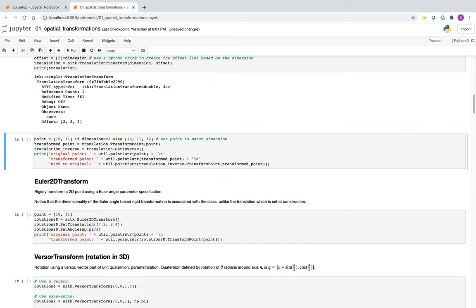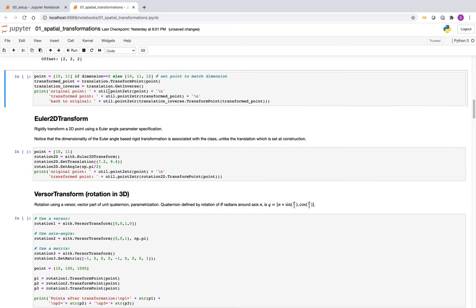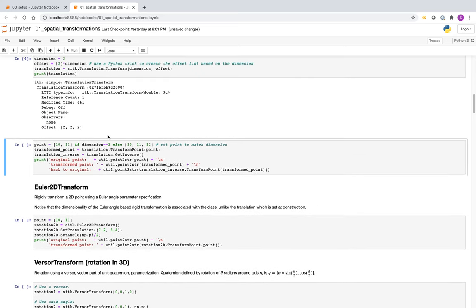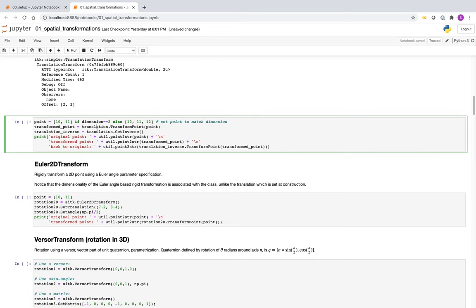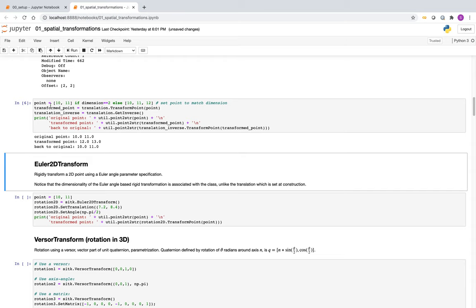Setting the dimension to 3 gives a translation transform with values (2, 2, 2). Returning to dimension 2 and running the transformation: we create a point (10, 11) and apply the translation, getting a transformed point that is just plus 2 in each coordinate, as expected. All global transformations have a get_inverse method, which returns the inverse transformation. Applying the inverse to the transformed point gives us (10, 11) back.